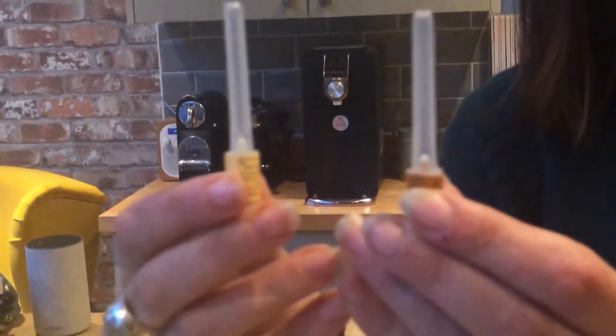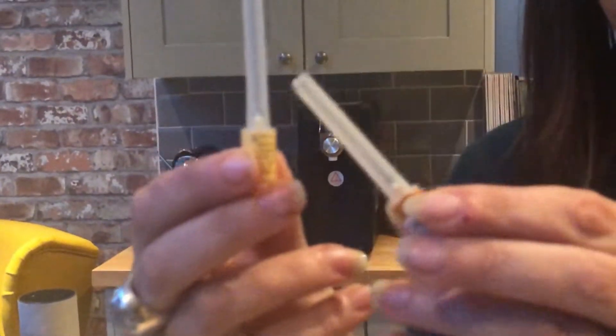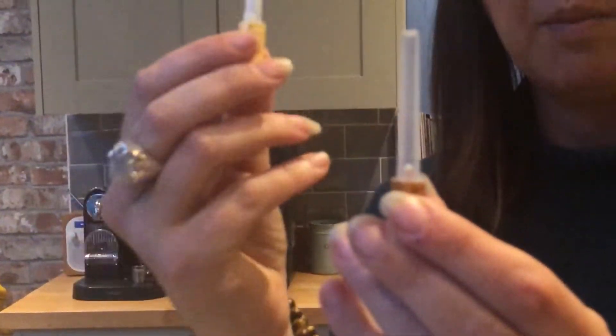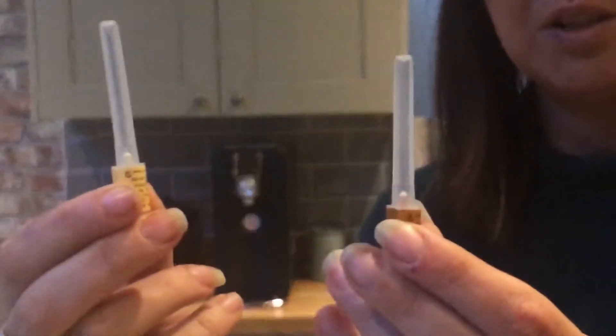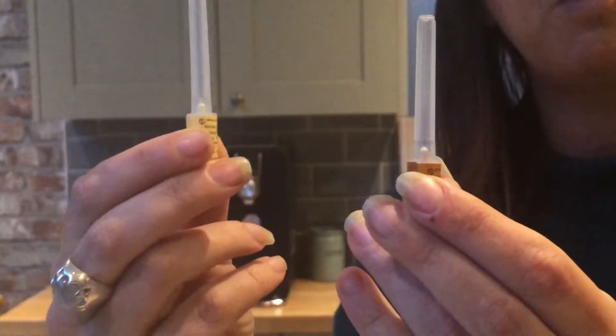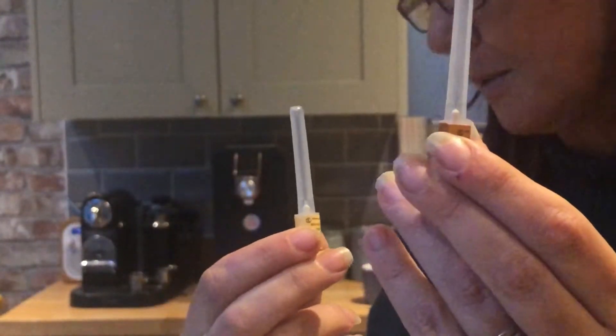So one of them is a very long needle, one of them is a very thin short needle. One of them is for mixing the solutions, one of them is for injecting yourself. Do not get this wrong — Richard would probably divorce me if he put the long needle in his stomach instead of the short one.